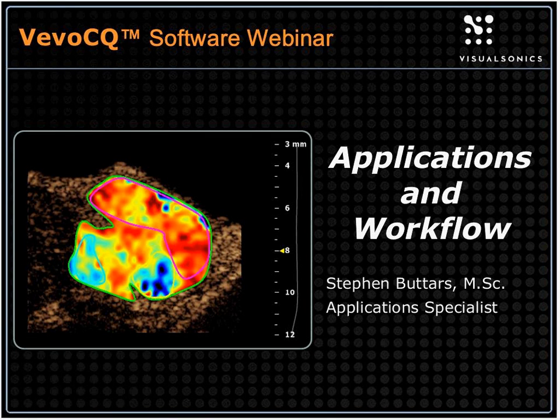Joining us today. Andrew Needles, I'm a product manager at VisualSonics, and today we'll be giving you an interactive webinar looking at VevoCQ software.